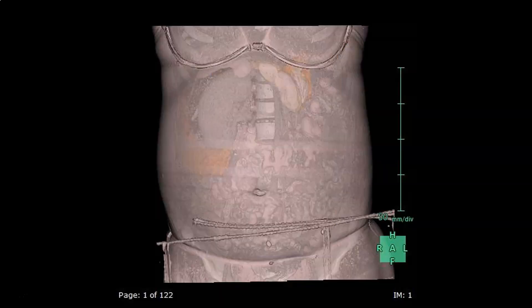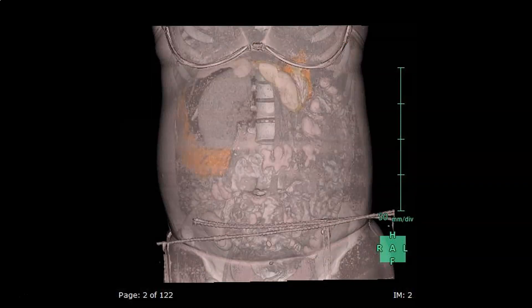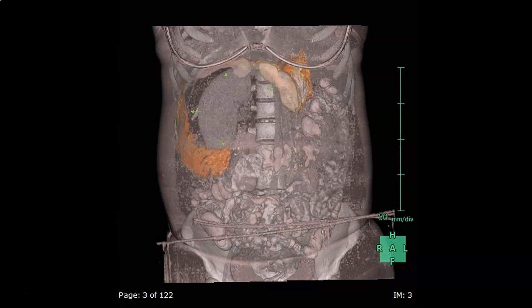Here we will see some of the lesion's anatomical relations in 3D. This is the widening of the C-shape of the duodenum, a classical sign in the old days of barium meal to diagnose pancreatic head lesions.